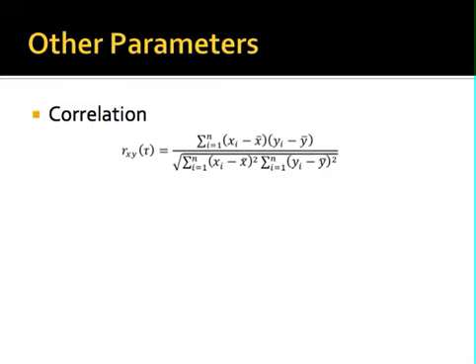So, for those of you who are really stressed that there's all this really complicated neuroscience and engineering and physics that go into making these models to understand EEG data, just be informed that there's an awful lot that you can do in analyzing the EEG and using it as a biomarker without even trying to do any source localization or dipole fitting.